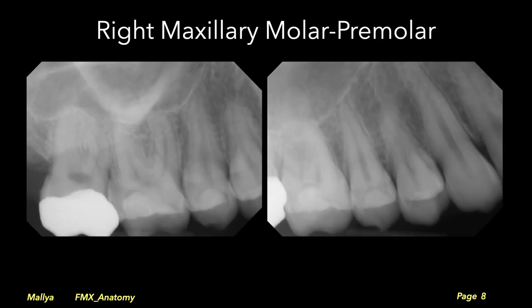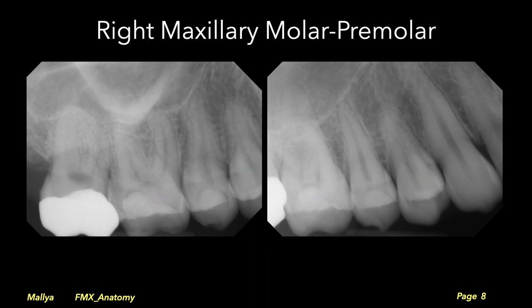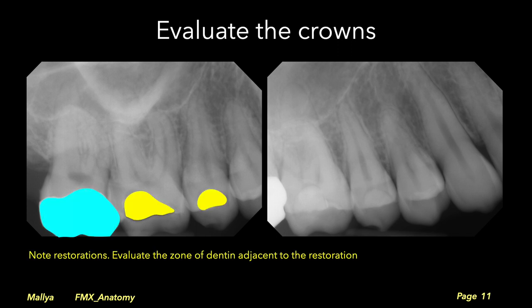Now let's start with the radiographs of the right posterior maxilla. The first step is identification of the teeth, accounting for any unerupted or missing teeth. Evaluate the crowns — you should see an intact cap of enamel which is more radiopaque than the underlying dentin, and the dentino-enamel junction should be a sharp interface. The radio density of the dentin should be homogenous. Evaluate the restorations and the zone of dentin adjacent to them. Metallic restorations appear much more radiopaque than composite restorations. This is important to detect recurrent caries. Also consider that radiolucency under a restoration may be due to a liner and not recurrent caries.